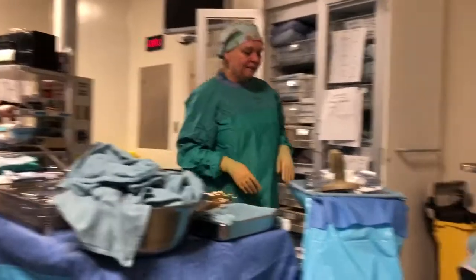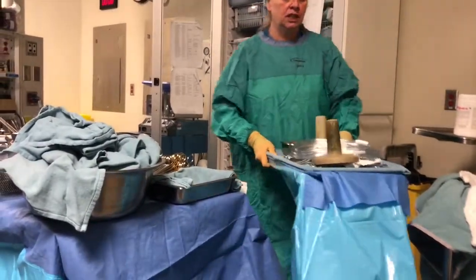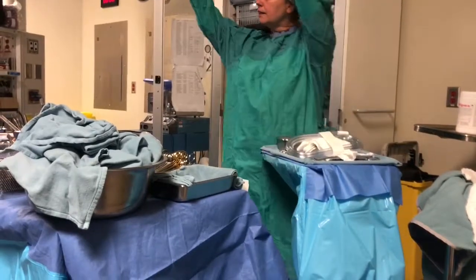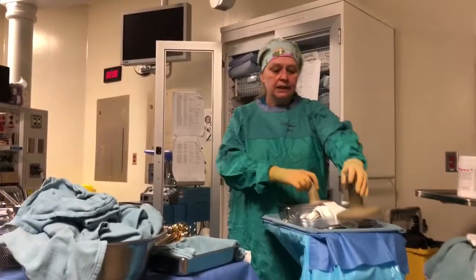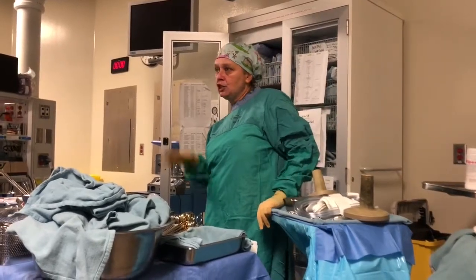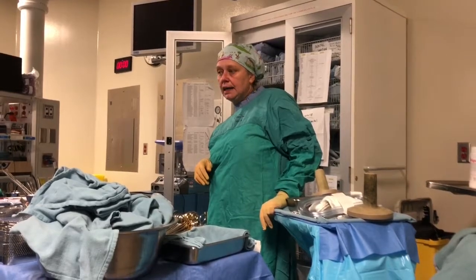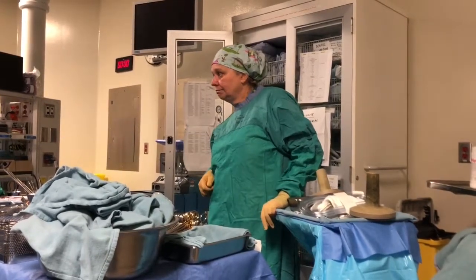No. So, basically, I would slide this up and over the patient, and then they would go click to the light handles. They would get the suction up, and then they'd use a Kelly to hold it so it doesn't fall off, right? And then they would cut, right?